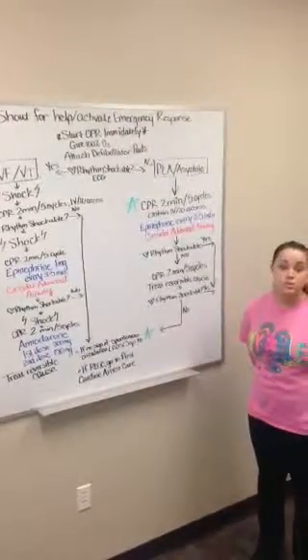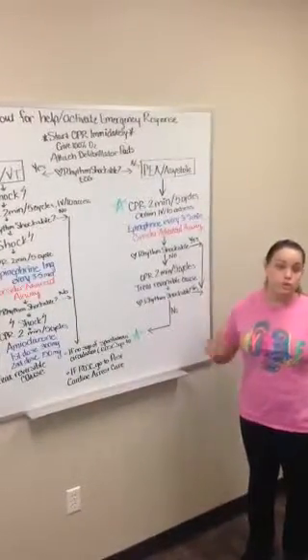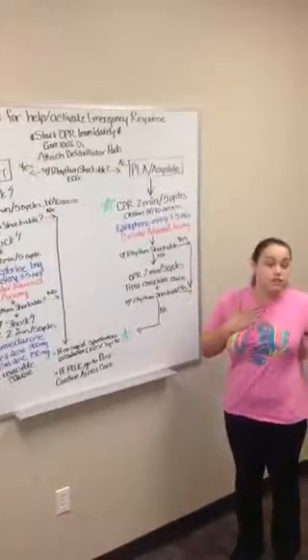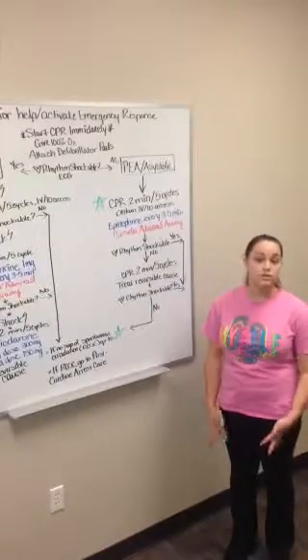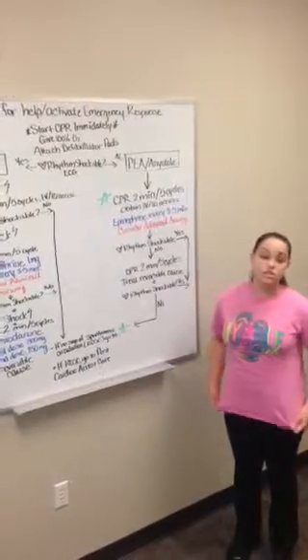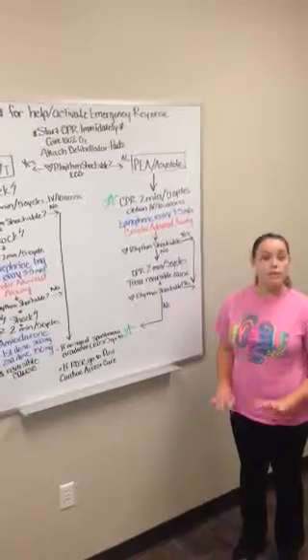In the United States, we use a biphasic shock, which runs from the right upper defibrillator pad to the left lower and back. This stops the heart in its tracks and helps it restart itself. As soon as you deliver the shock, you will begin CPR immediately.